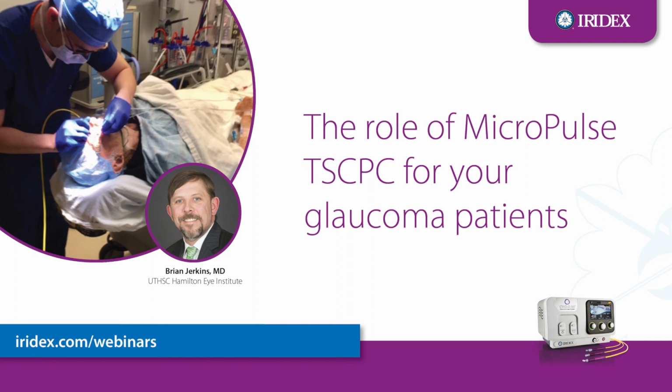If it's an avascular area, say they have a previous avascular bleb, or very, very thin conj over a tube, I still avoid that area. So there will be some patients that I may avoid a clock hour or two completely, just to avoid any risk of complications.